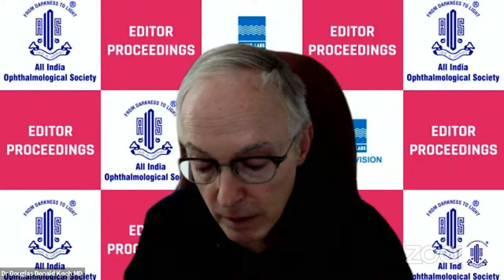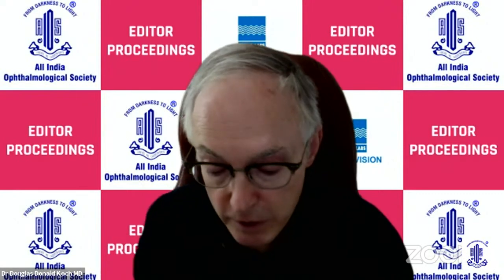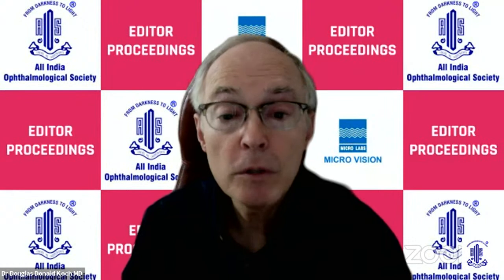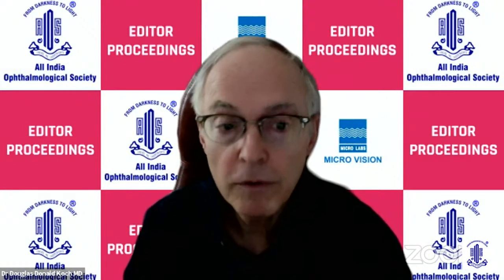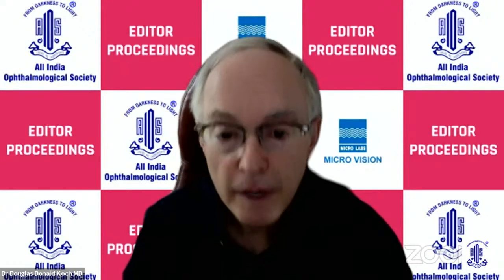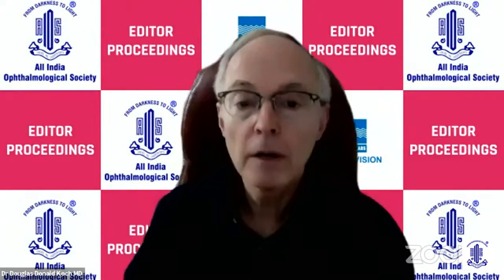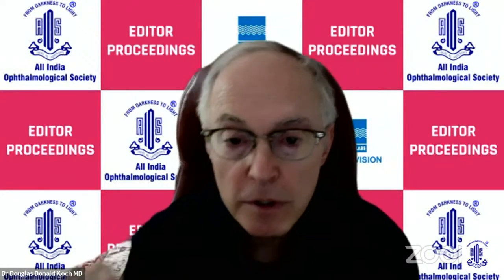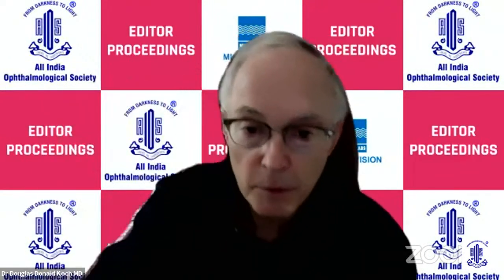And I think if we're doing what Sri talked about, which is a consistent capsular rhexis, that is the same. I mean, let's face it, most of us do just about the same thing, don't we? We have a 2.4 millimeter incision, a 5 millimeter capsulorhexis, and the lens is in the bag. And unless there are racial or national differences, is a Caucasian eye different from a South Indian eye, from a North Indian eye?